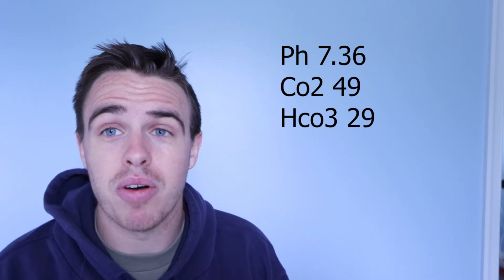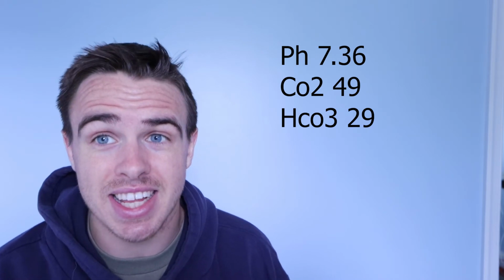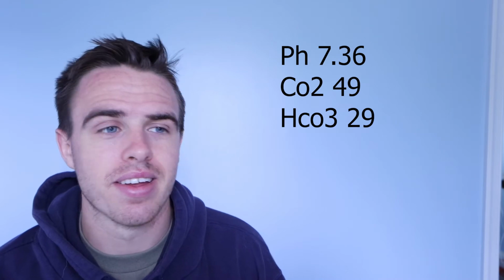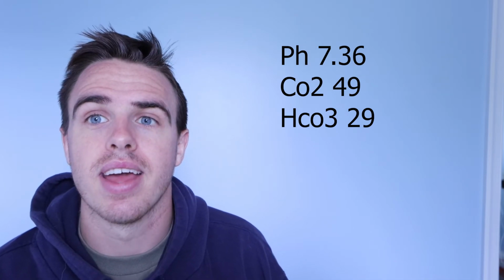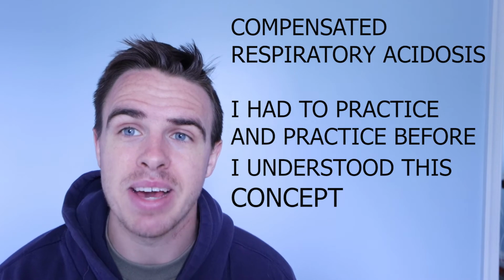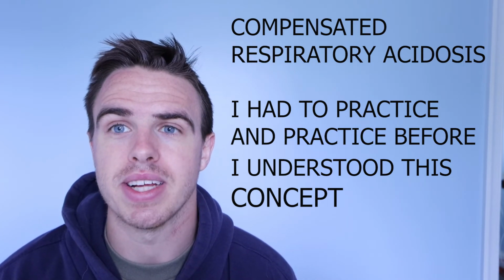However, if you went to ABG Ninja and had to say exactly what was going on with this ABG, this would be a compensated respiratory acidosis.